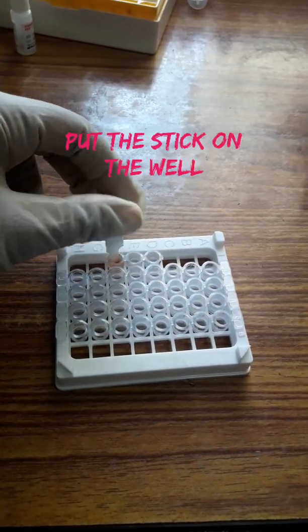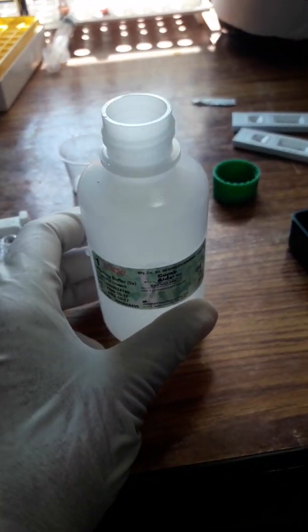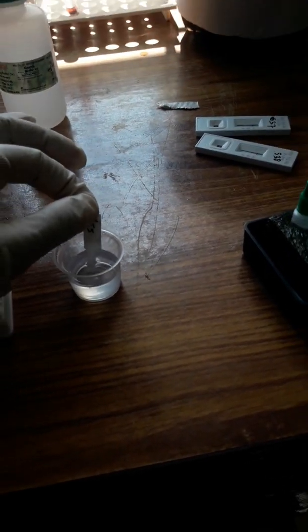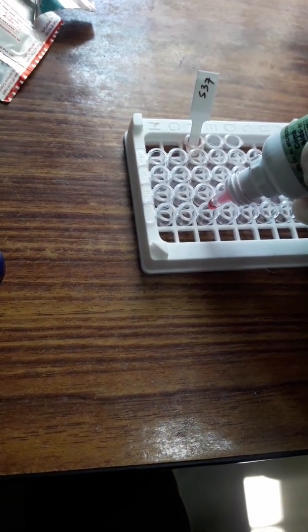With the help of the comb stick, mix the blood serum and sample diluent properly, and place the stick on the well. Wait for 15 minutes. After 15 minutes, wash the stick with buffer solution and dry the stick.